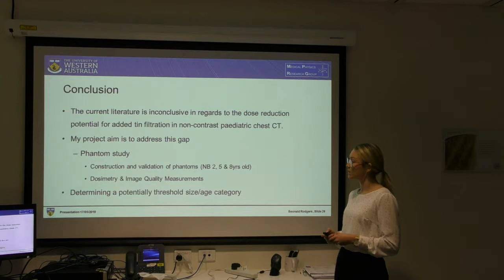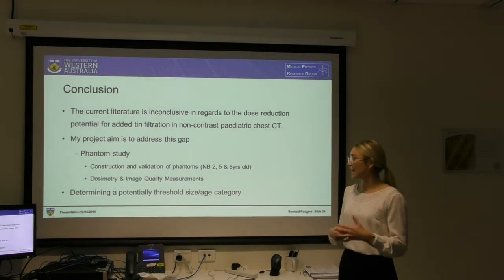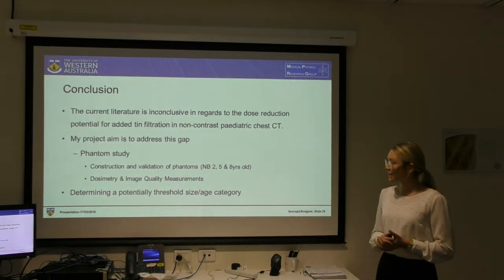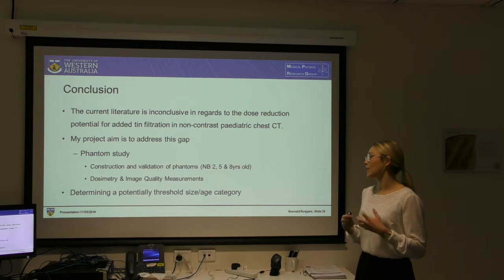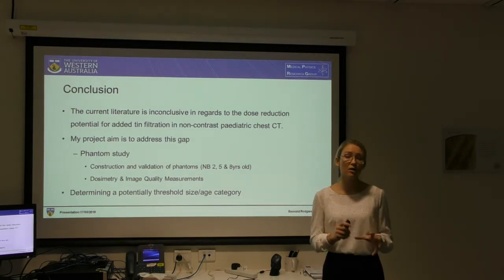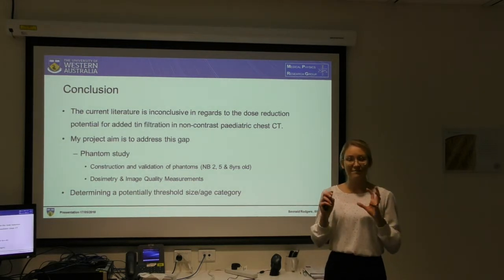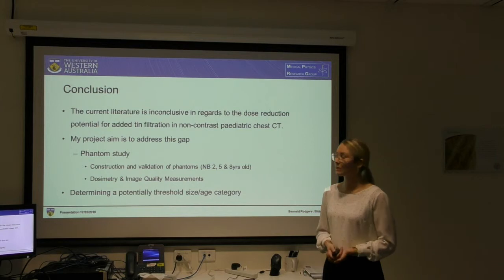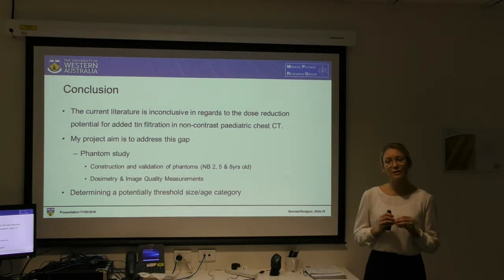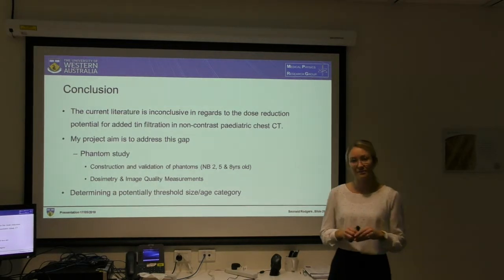Dosimetry and image quality measurements will be used to analyse the dose reduction potential of tin filtration. A secondary aim of my project will be to determine a potential threshold size category below which tin filtration is no longer the most appropriate method of scanning paediatric chests via CT. Ultimately, we would like to reduce paediatric CT doses and limit the associated risks of cancer due to this.